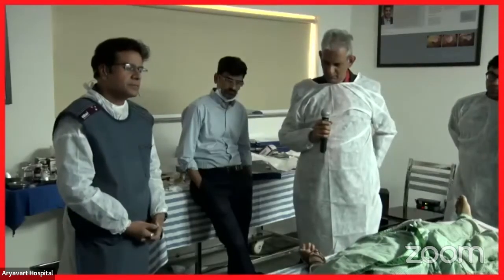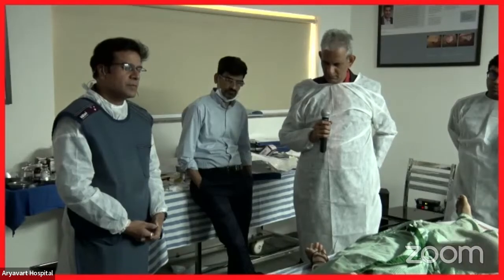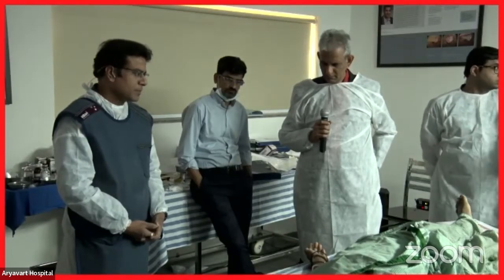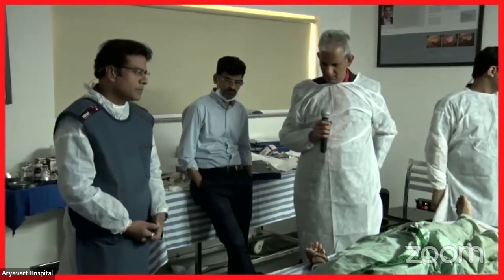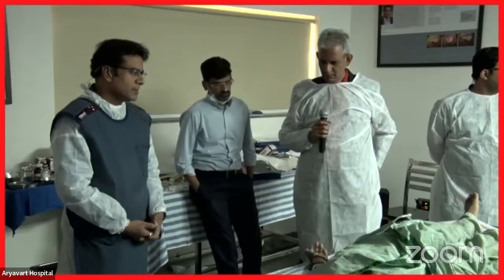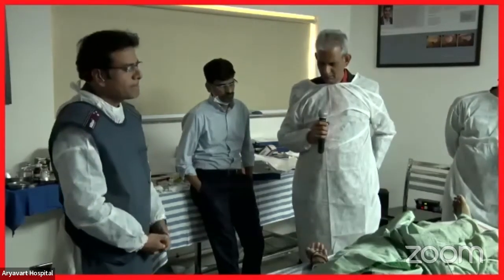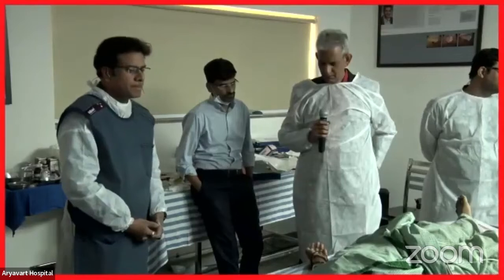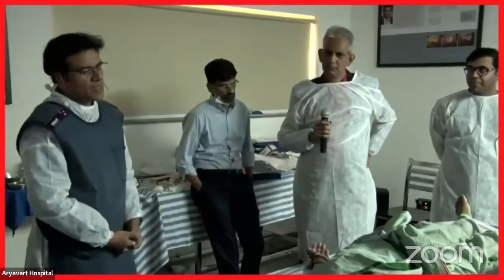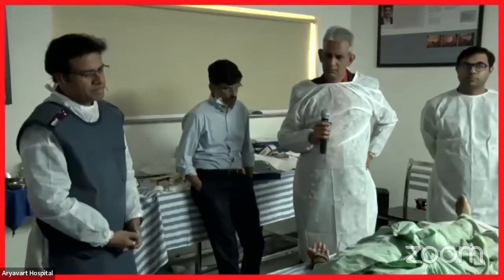One or two more tricks I have: instead of inserting normal unagitated saline, I would suggest inserting agitated saline, which has bubbles, because the fluid alone is still and you may be unsure. Bubbles are better seen with water. That is one thought; if others have any comment on it.